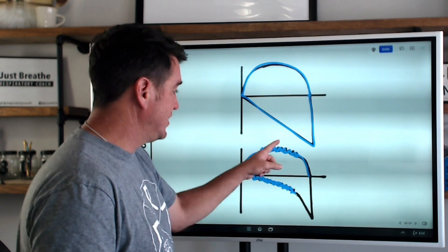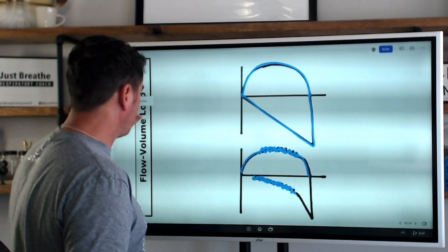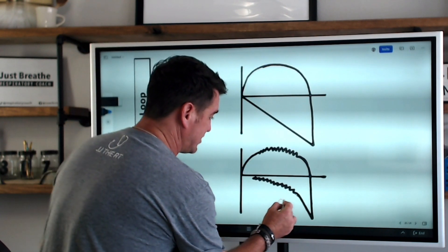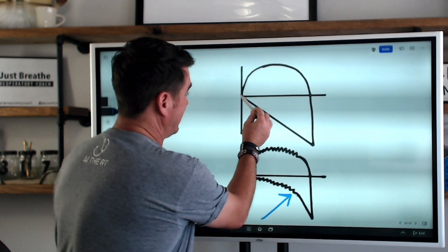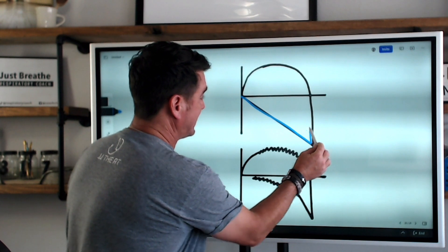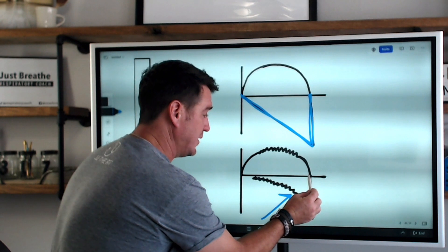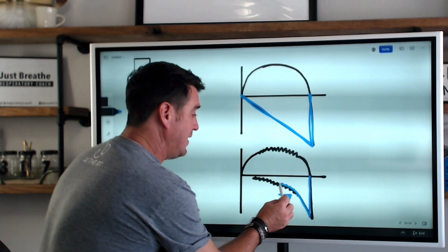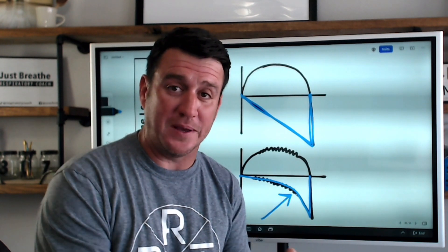Now the next abnormality — look at the scoop in the loop. This one comes straight back down during exhalation and right back over. But look at this one — it comes down and then scoops inward and then comes over. This is what I like to call the scoop in the loop, and any time you see a scoop in the loop, you need to recognize that you're dealing with some sort of obstruction.